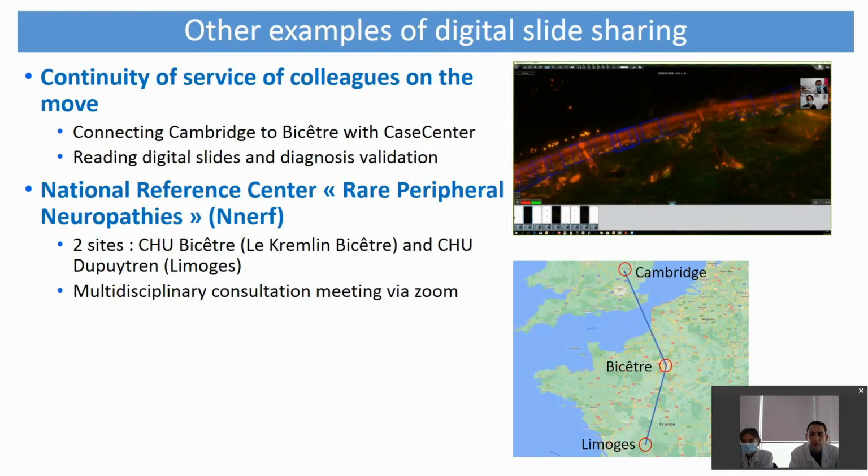The first example is with my colleague, Dr. Labéry. Last year, before the COVID-19 crisis, she went to Cambridge, following her husband for a one-year research project. Thanks to the case center, she was able to continue to read digital slides of skin biopsies produced in Bicêtre Hospital, and she validated diagnoses during video conference with me.